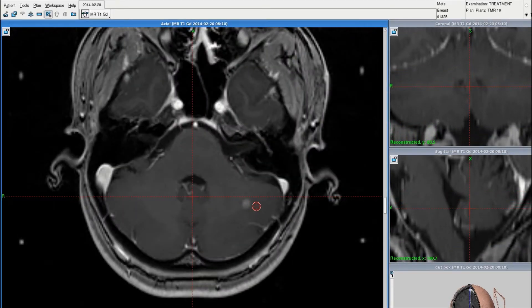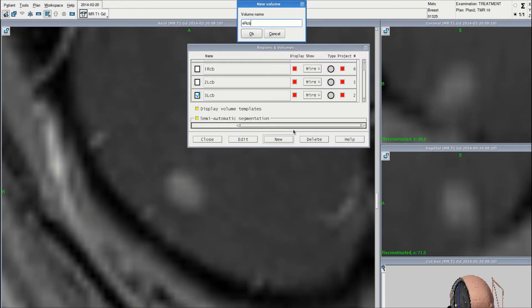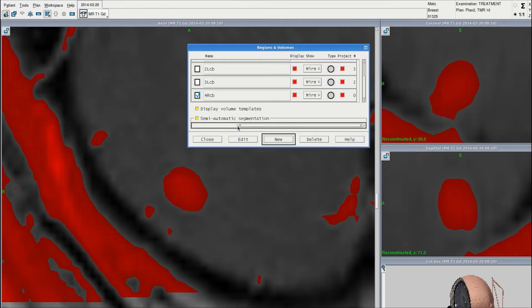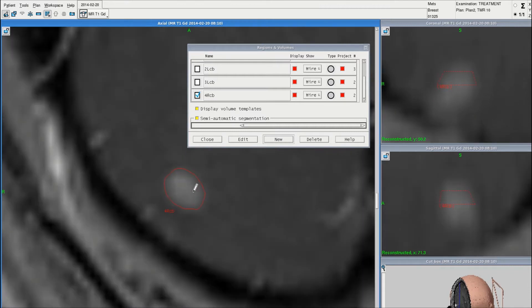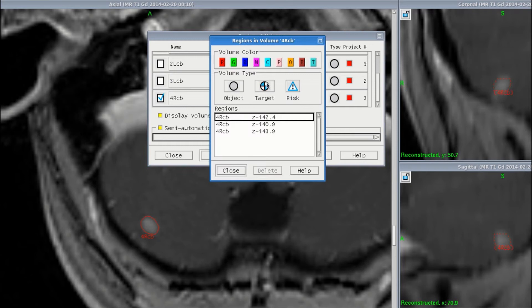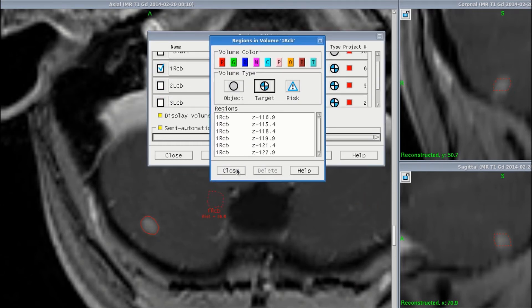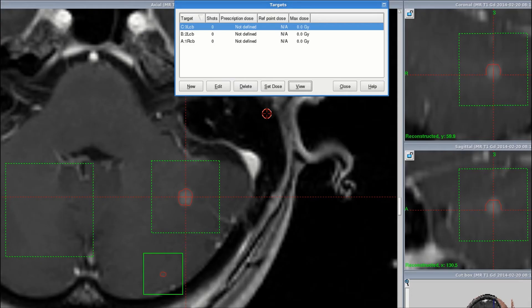In this patient we have four lesions to which we each want to give a dose of 20 gray. First let's outline the lesions and define them as targets. Then let's place target matrices around each of these lesions. Now we're ready to plan each target.